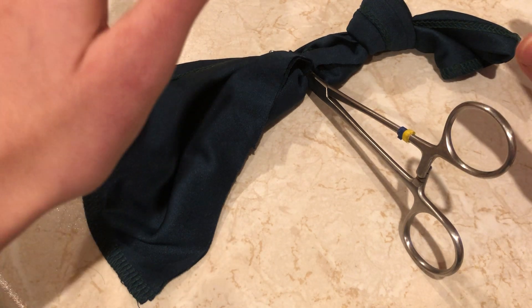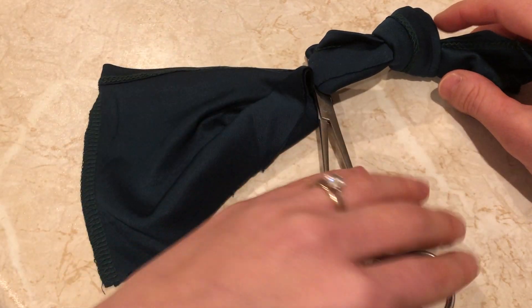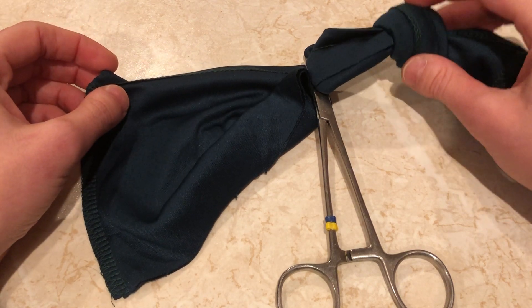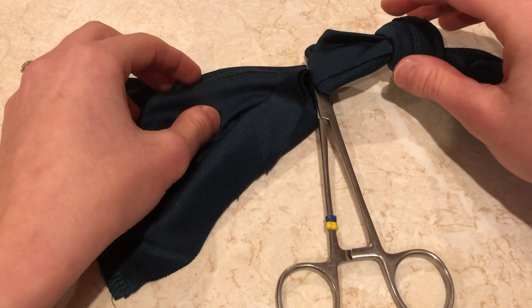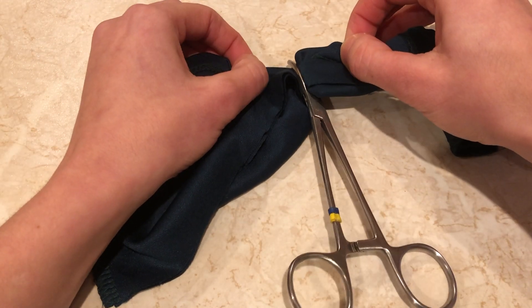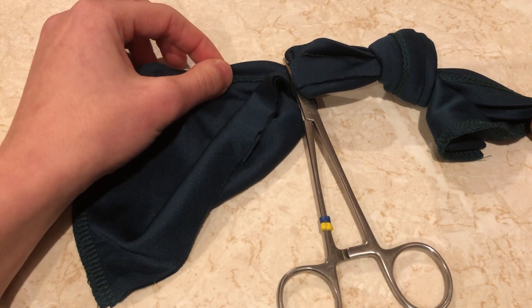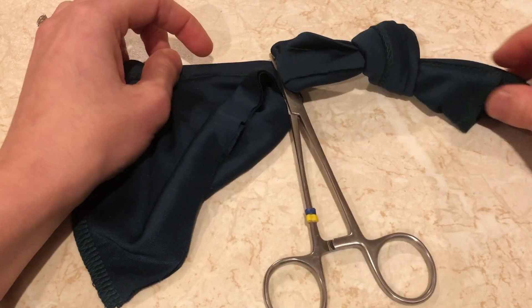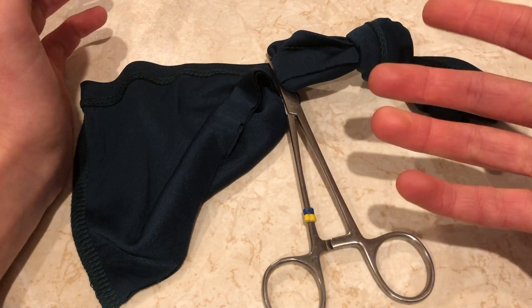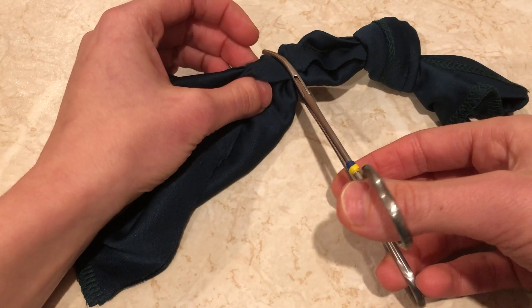For the purposes of this demonstration I've got this piece of fabric — it's just an old hem from a dress — but basically this knot represents the ovary. This is our pedicle, our vessels are here, the ligament which we would have stretched or broken or cut is there at the cranial leading edge, and then this bit would have been attached to our uterus. We've made a window here just as you would have been taught to anyway.